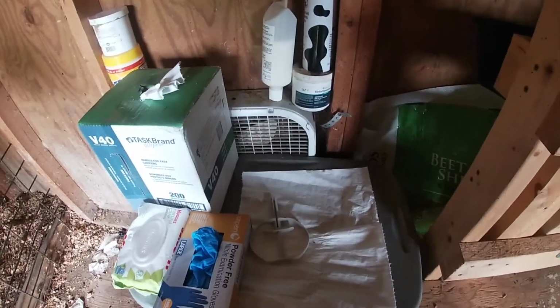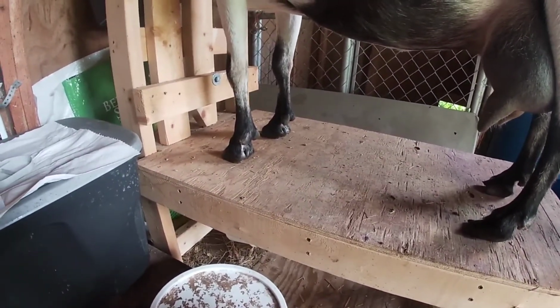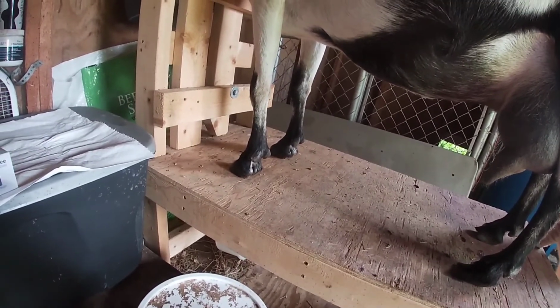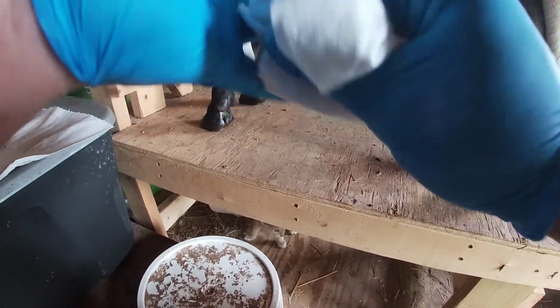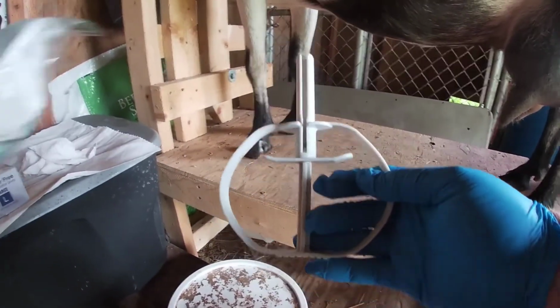and that's the dairy doe. Okay, so this is the same process as before. I always clean the does off before I insert a CIDR, just because, you know, of what they've got on their backside. Some people don't, but I do, so I'm not going to show you that part because you don't really need to see it. Make sure you put some sanitizer on your applicator.